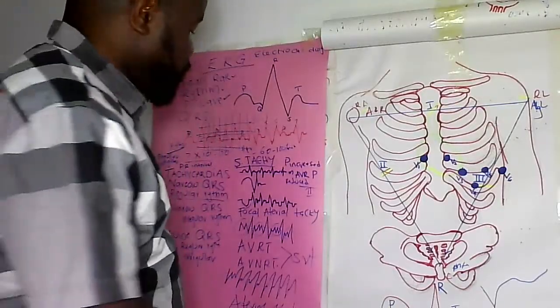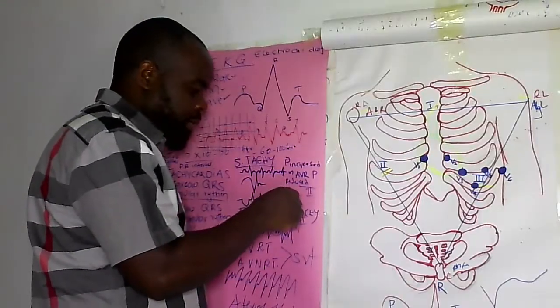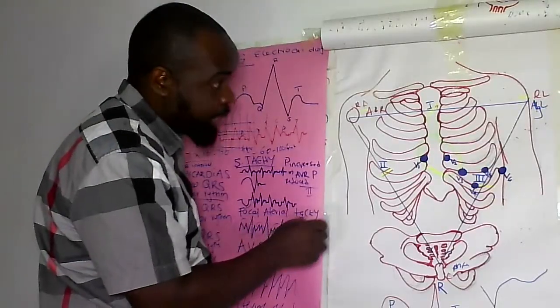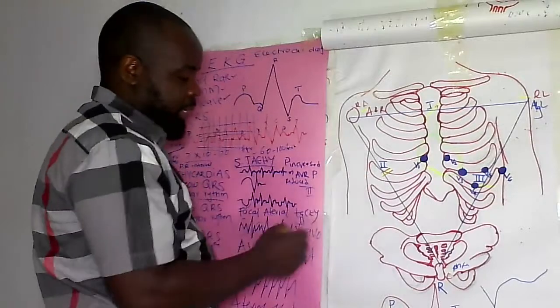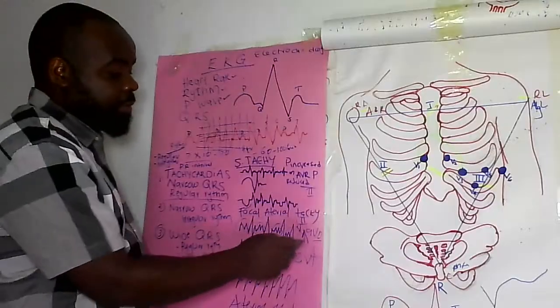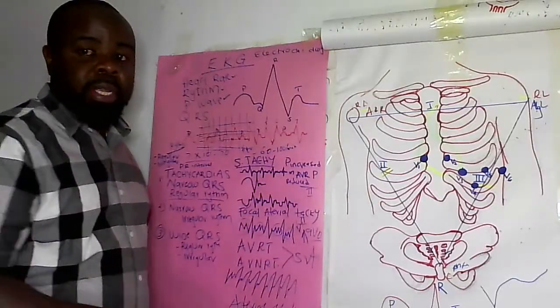Now in lead 2, the P wave deflected down. You get, but when you check on the AVR, the right side, AVL, AVR, it is up. So when you check on the strip of the EKG, you look at the AVR, it is up, but on lead 2, it is down because of deflection on the left side.